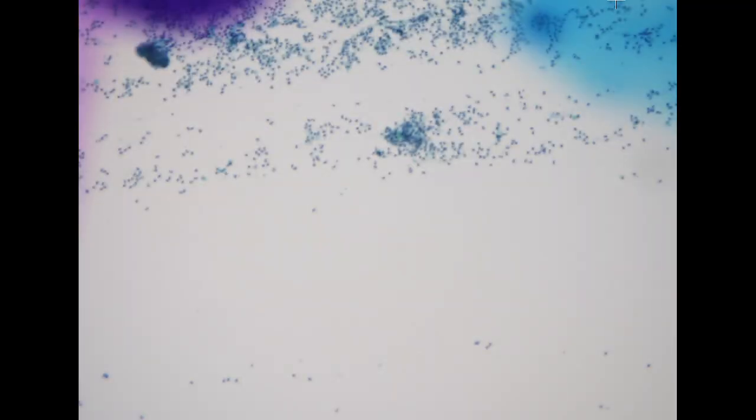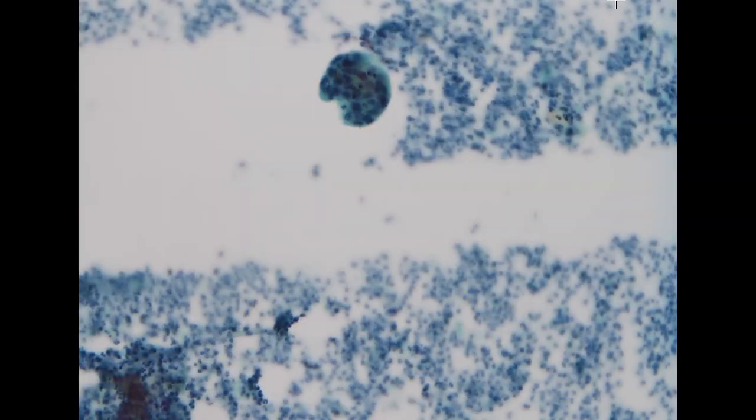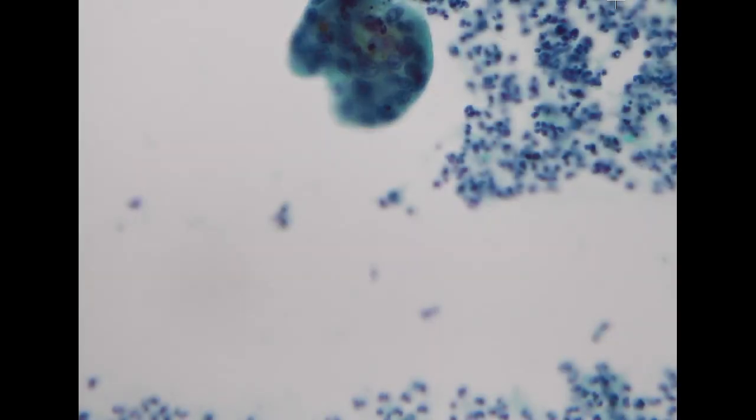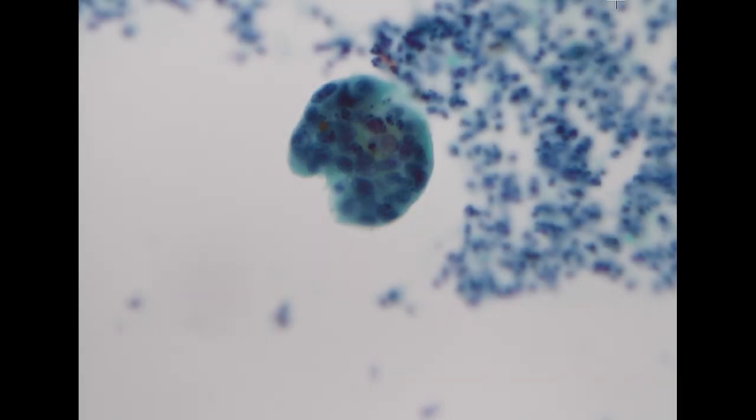So the next specimen has a past history of lung cancer. And this is the pleural effusion specimen. Again, this cancer we are very familiar with. It's easy to detect because it almost always forms a tight cluster with high-grade nuclear atypia. So this is positive for adenocarcinoma.